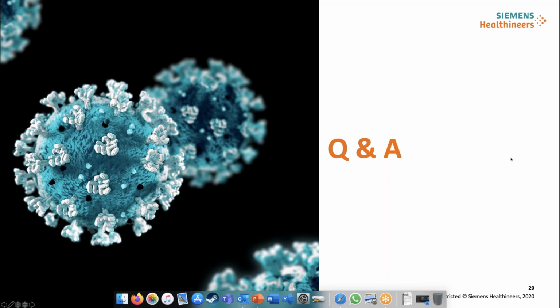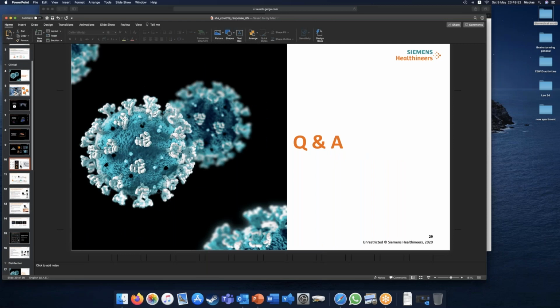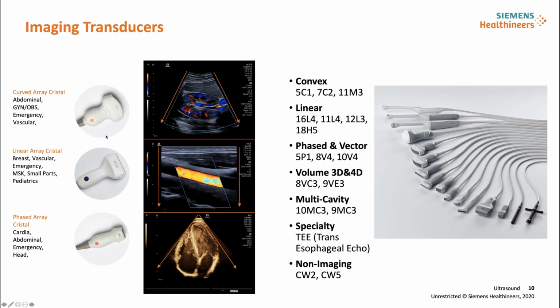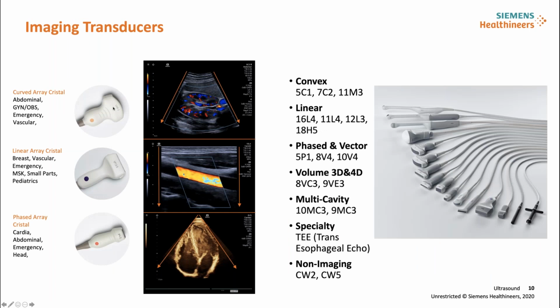I have again a transducer question. Which type of transducer? Let me put my presentation up and I will show the transducer page. Basically, any of those three transducers you will see here, and again, it's just a type, not with any kind of frequency. You can do lungs with all three. You can do lungs with convex, and believe me, I would say 95% of the ultrasounds in the hospital will have this transducer. It's the basic.